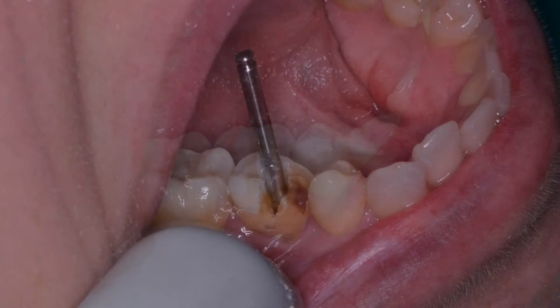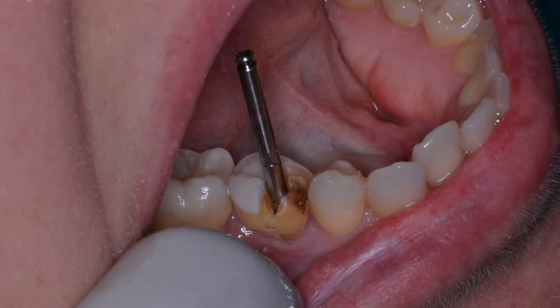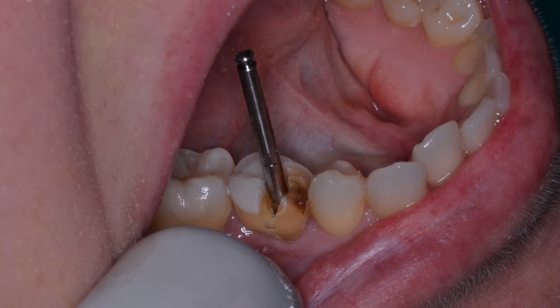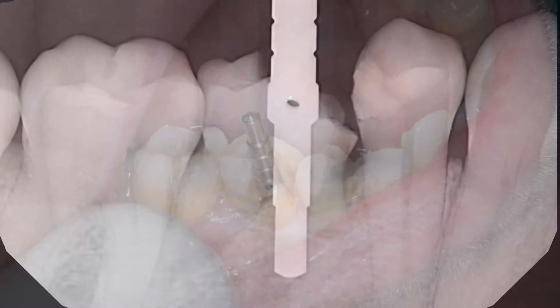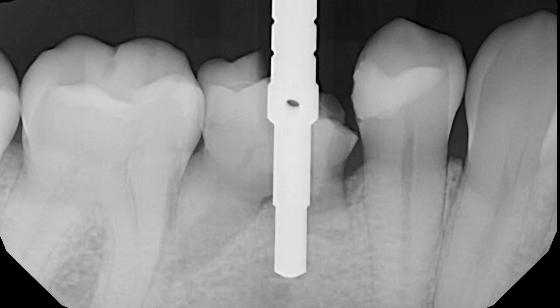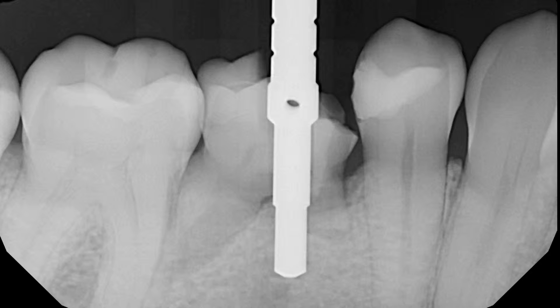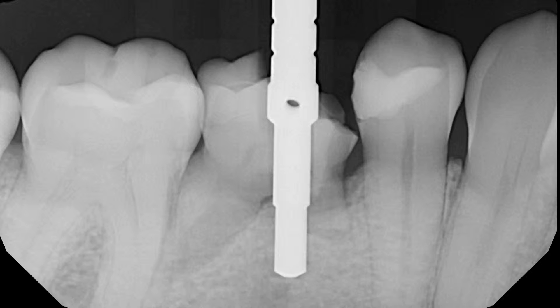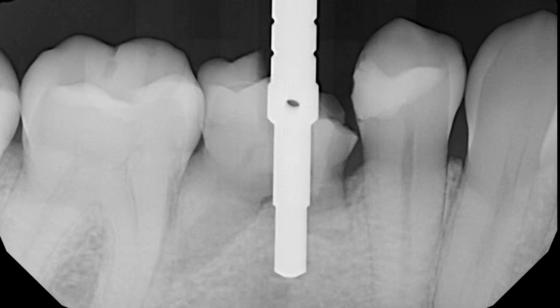We placed the guide pin and took a radiograph to ensure it was going in the correct position. From this radiograph you can see we've gone through the furcation area and have a beautiful osteotomy. It is parallel to our premolar and in the correct area of bone. Though you can't see the mental foramen here, we are well away from it.